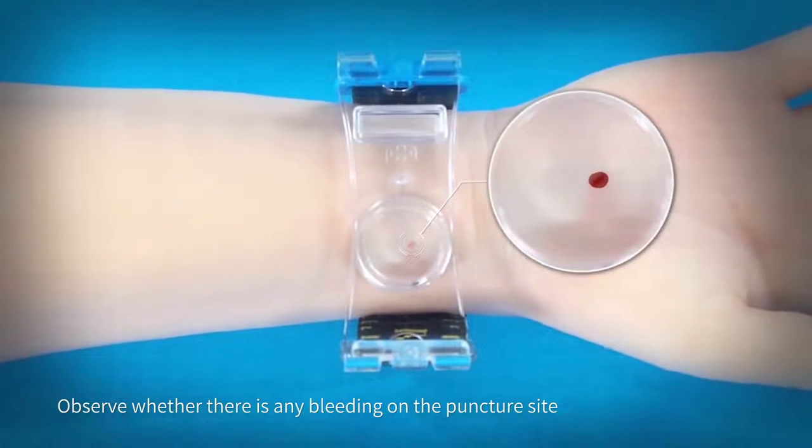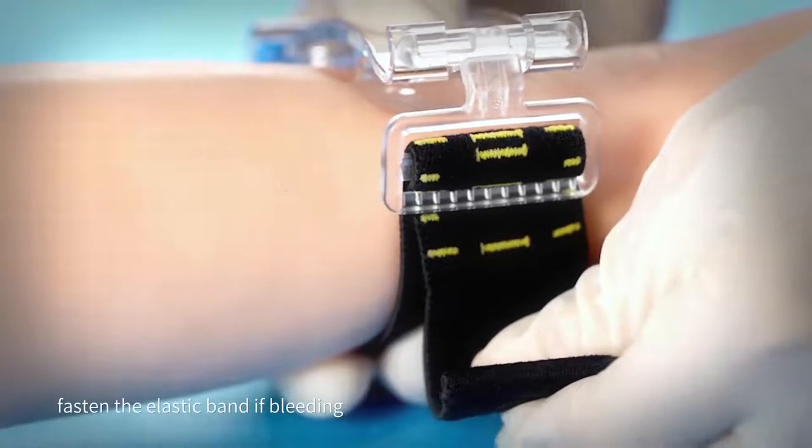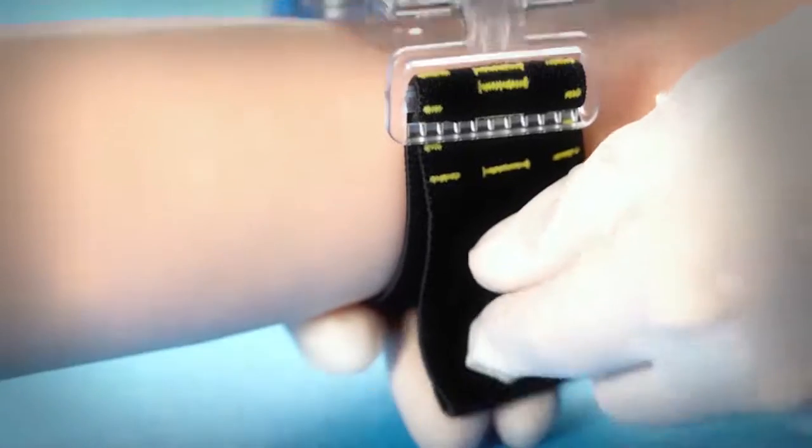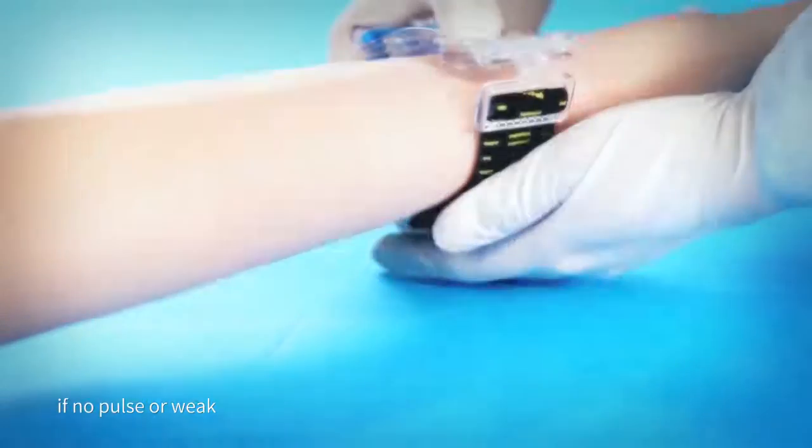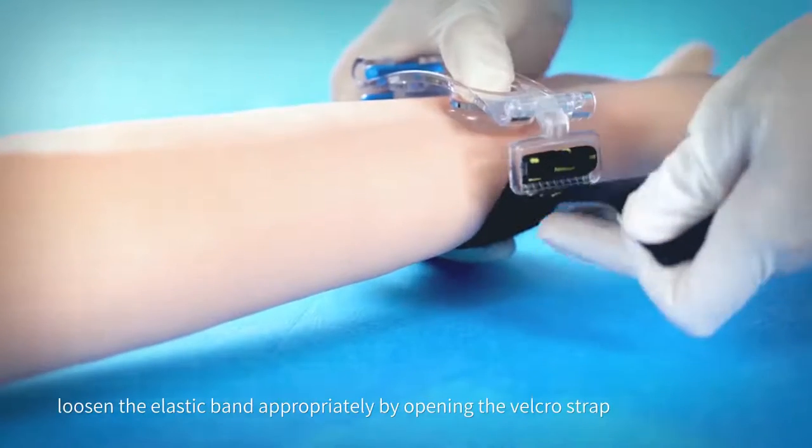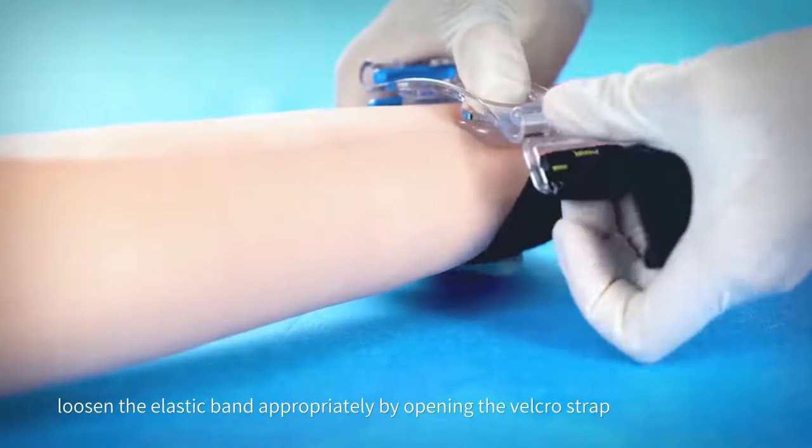Observe whether there is any bleeding on the puncture site. Fasten the elastic band if bleeding. Touch the distal radial artery to check the pulse. If no pulse or weak, loosen the elastic band appropriately by opening the Velcro strap.